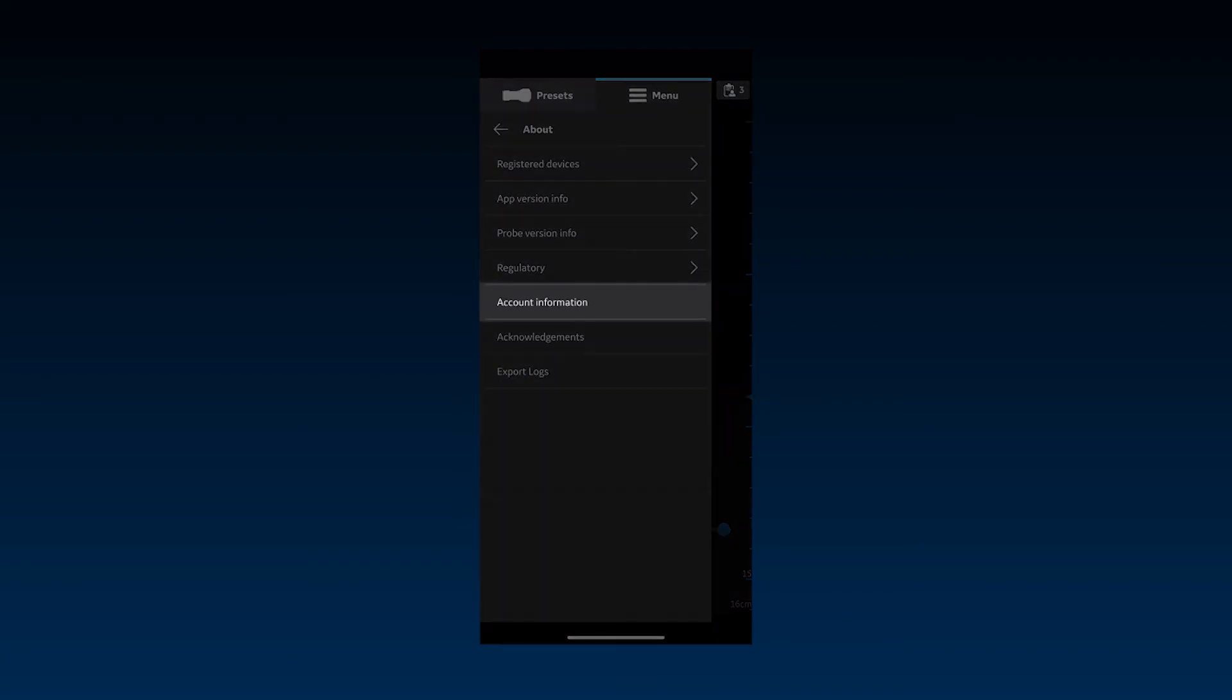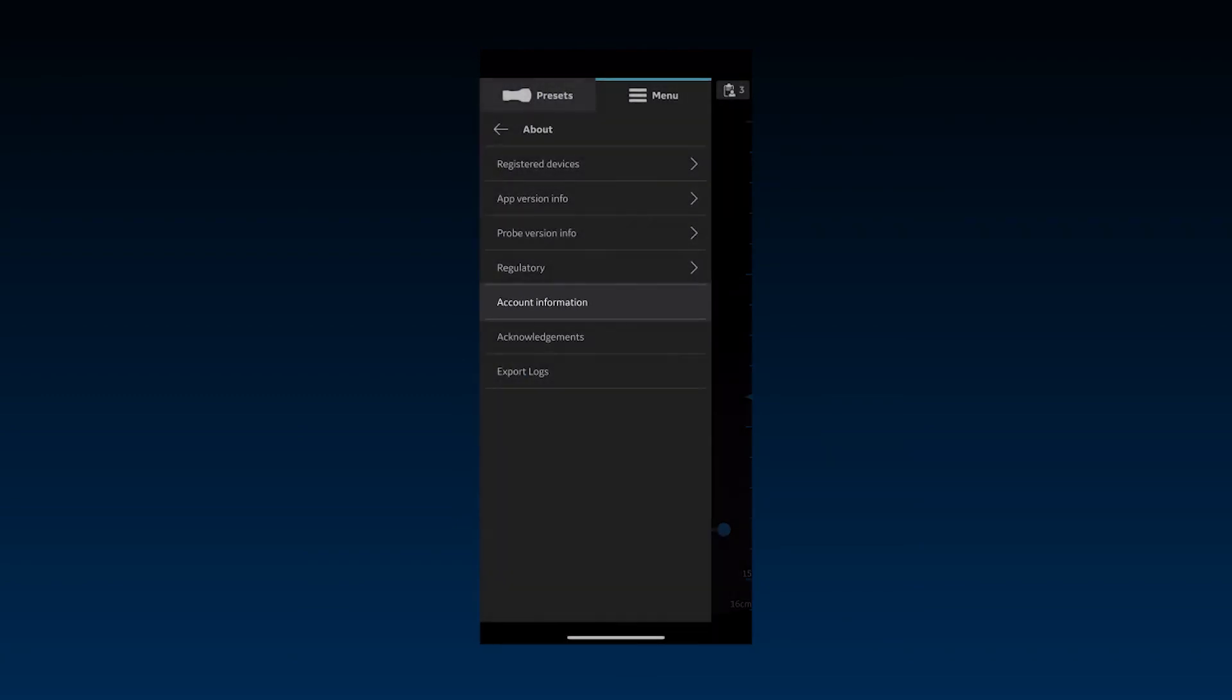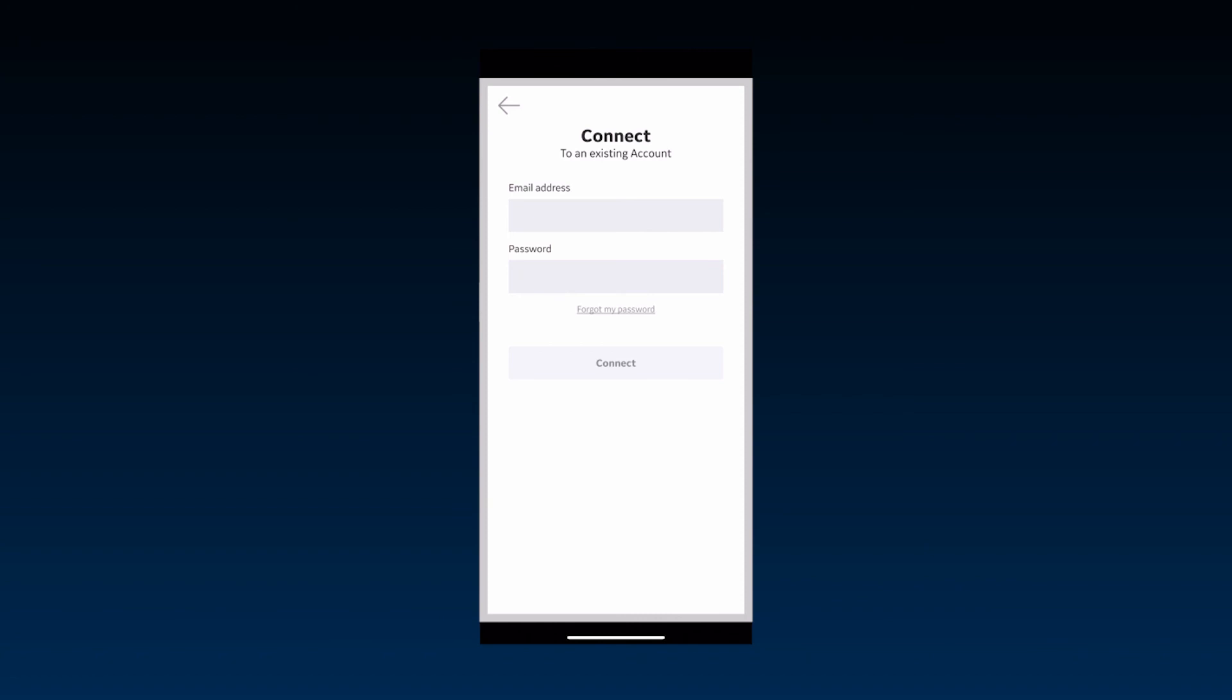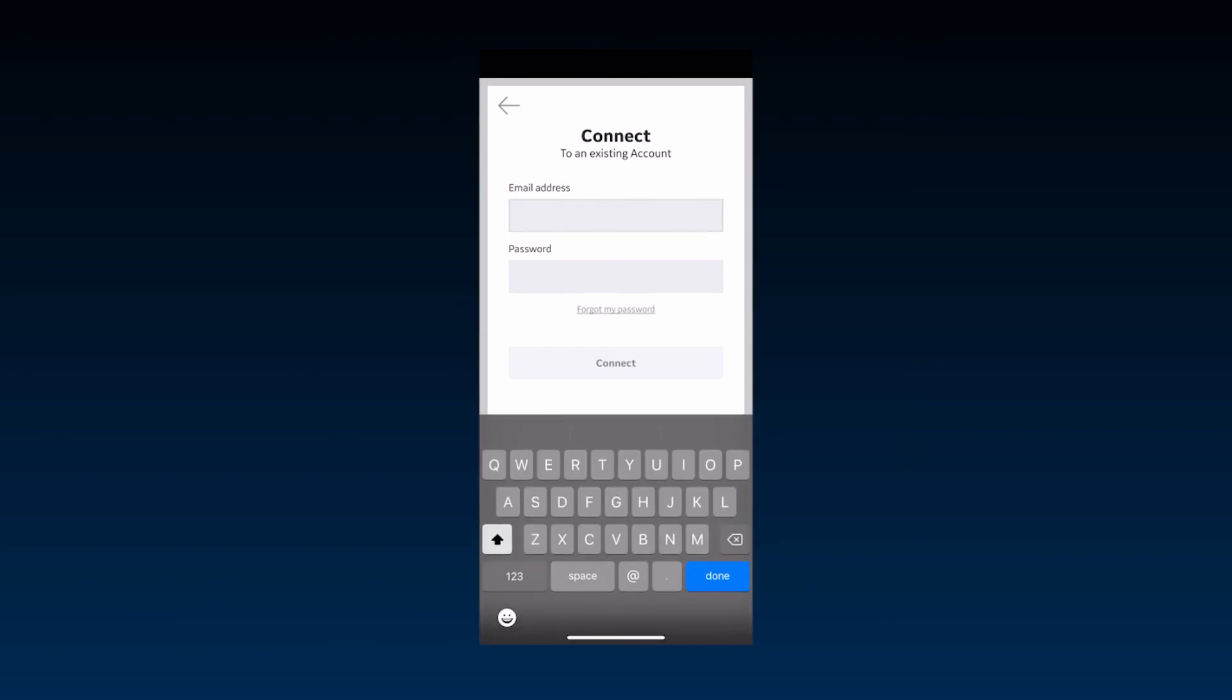The Account Information section allows you to access your registered account and make changes if needed. Enter the registered email address and password to connect.